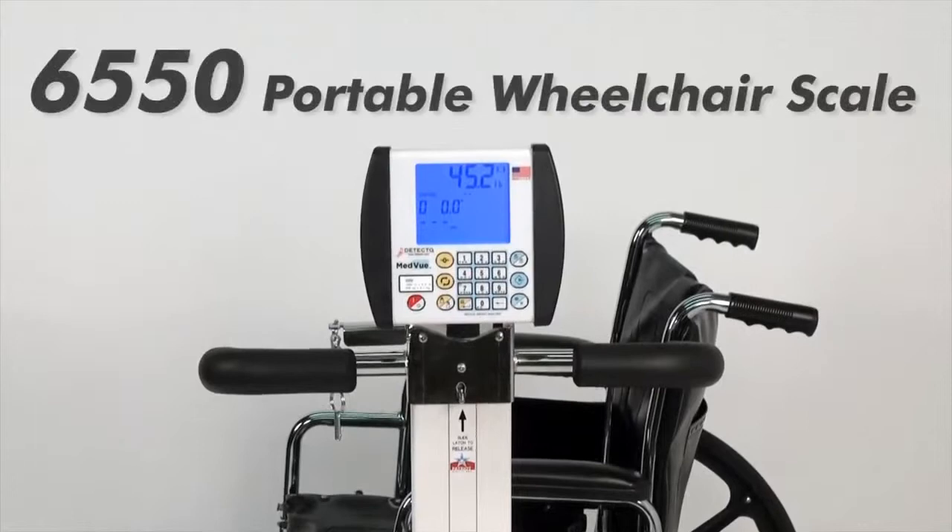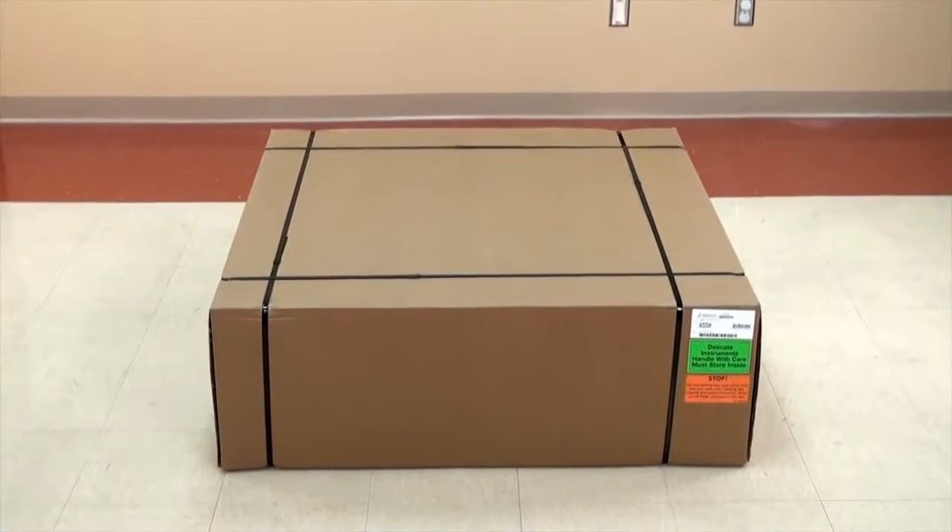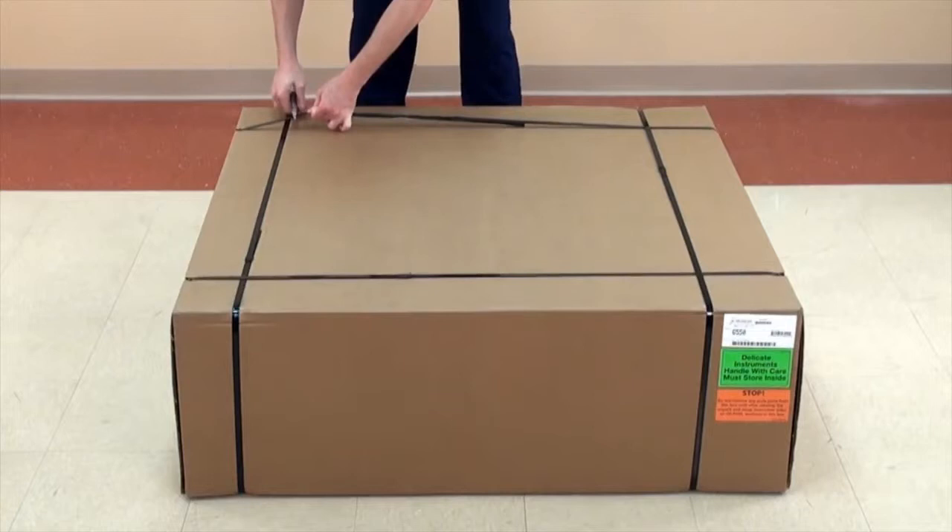This video will guide you through the setup and operation of a USA-made Detecto 6550 Fold-Up Portable Wheelchair Scale. This sturdy but lightweight unit is exceptionally easy to handle and is snapped to set up.